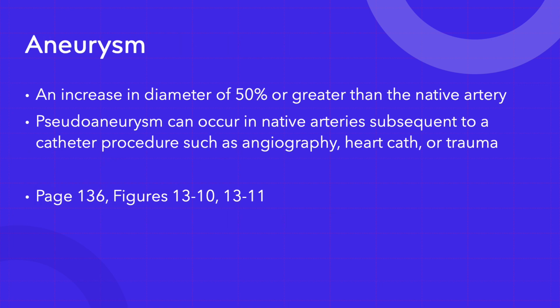An aneurysm is an increase in diameter of 50% or greater than the native artery. So if you're scanning the SFA and all of a sudden it gets bigger, stop and measure before the biggest point and after. If that size doubles, that's concerning.